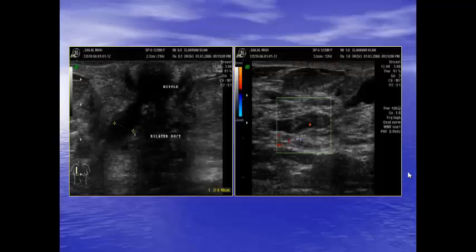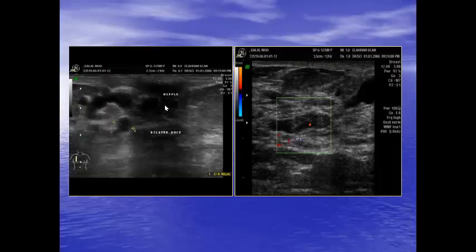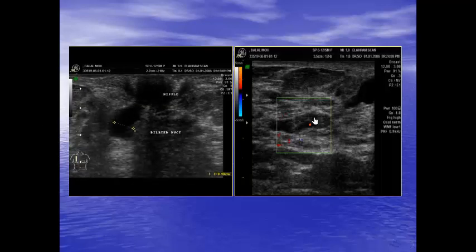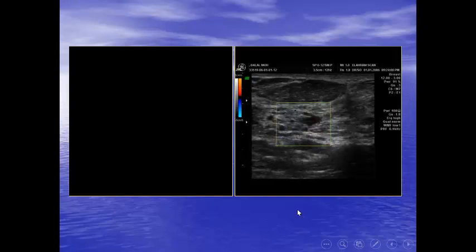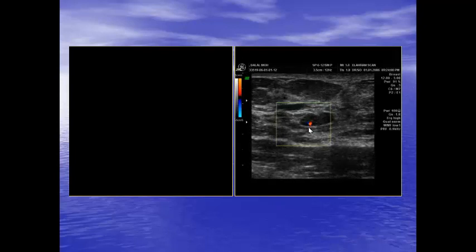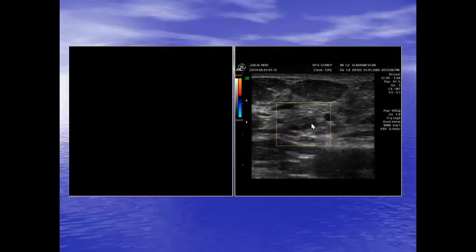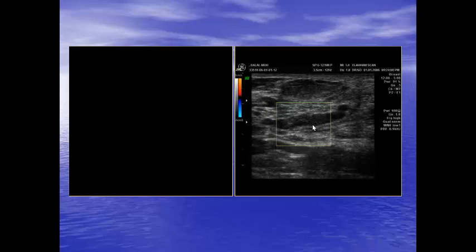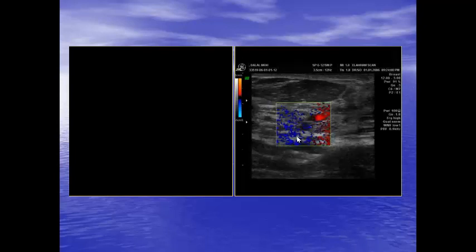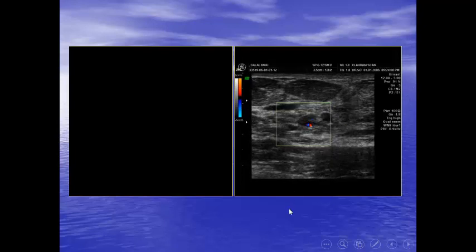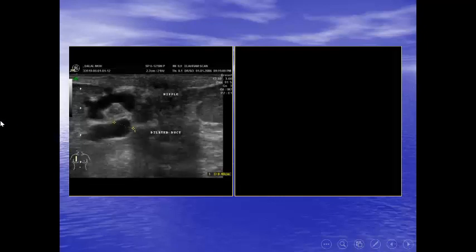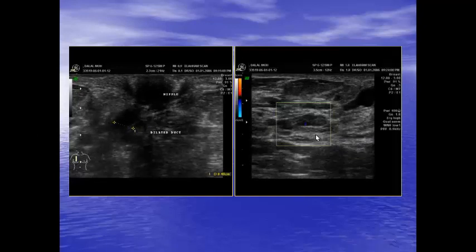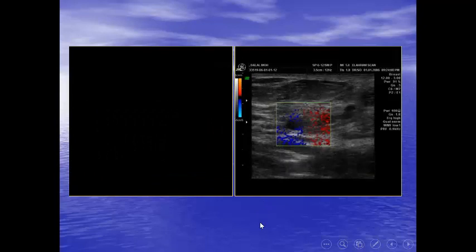Another case: a 38-year-old with uni-orificial bleeding. Here we have dilated ducts near the nipple. When we trace through the duct, we find a mass with vascularity inside. The vascularity is coming from one side, and we must assess it from multiple positions — sagittal and axial. The vessel is coming from the posterior wall of the duct: this is the vascular pedicle sign, more consistent with papilloma than carcinoma. Always trace the duct proximally to the lobules to ensure no mass is present. This was an intraductal papilloma.